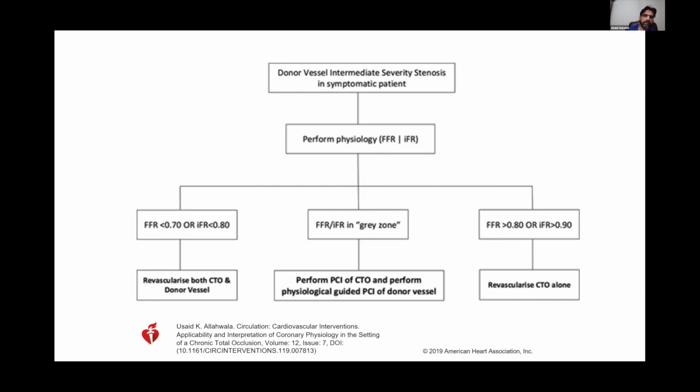A few small studies have shown that there's a small proportion of patients who would be reclassified from true ischemia to non-ischemia. It's usually in the order of 0.04 to 0.07. So if the LAD had truly an intermediate lesion and the FFR was, say, 0.62, it would be highly unlikely that that was related to collateral flow. That would really signify that the LAD indeed is ischemic.